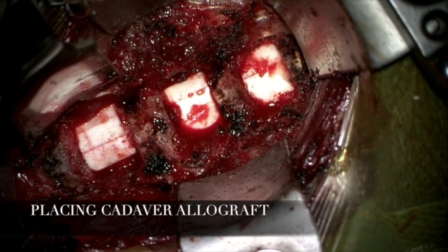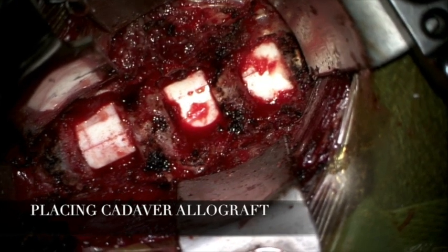At this point, weights from cervical traction were taken off. The grafts were tightly fitting and placed in position at each level.